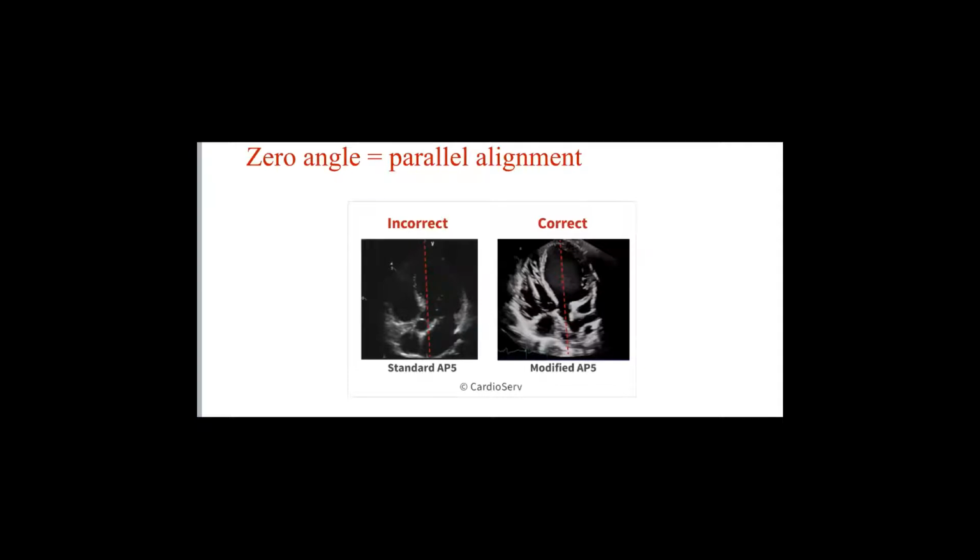Okay. And if we take the image on the left and reducing the sector, yeah, I agree with you. Reducing the sector is always good. You have to just confine your sector to your zone of interrogation and try to dismiss the rest, because that will enhance the image quality.